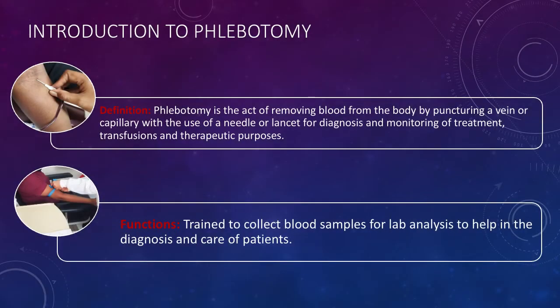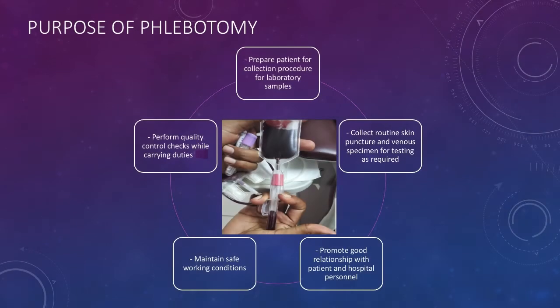Phlebotomy is the act of removing blood from the body by puncturing a vein or capillary with the use of a needle or lancet for diagnosis and monitoring of treatment, transfusion, and therapeutic purposes. Function of phlebotomy: trained to collect blood samples for lab analysis to help in the diagnosis and care of patients.